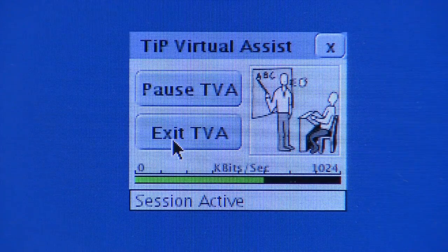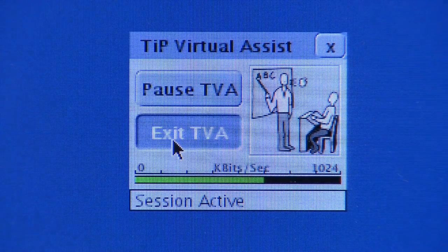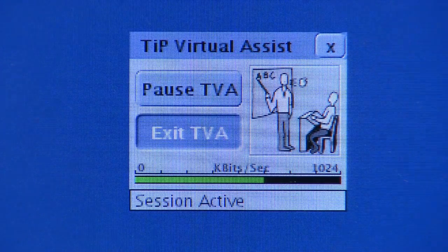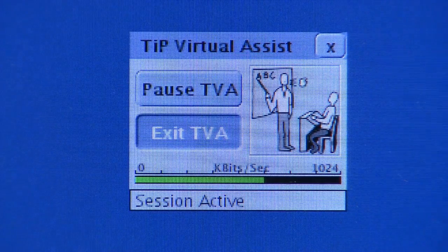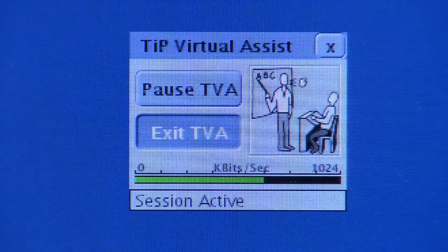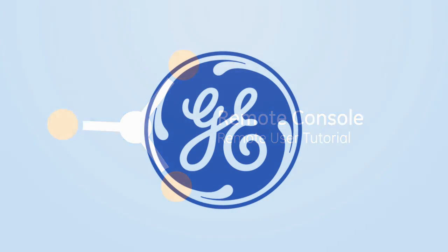There is an idle timeout, so if there is no activity by the remote user for 10 minutes, the connection will be dropped to free it up for another user. Thank you for viewing the videos.